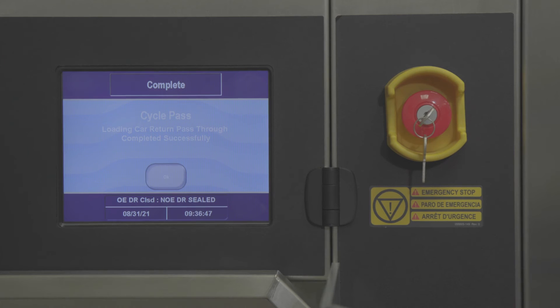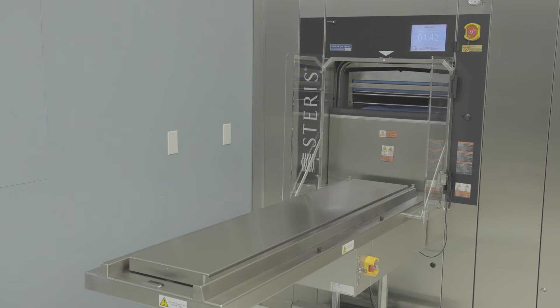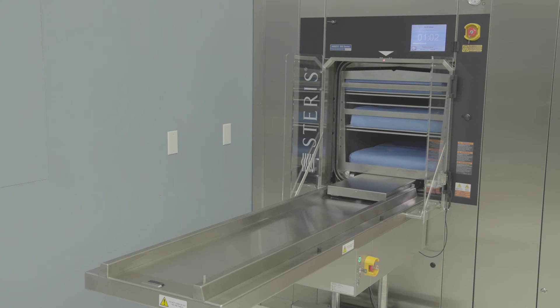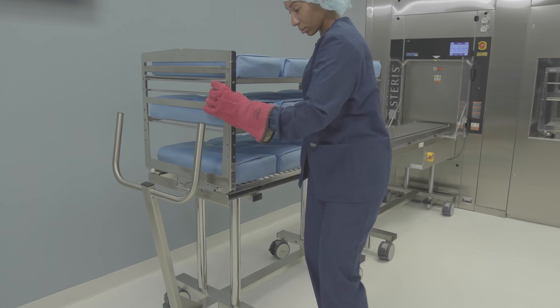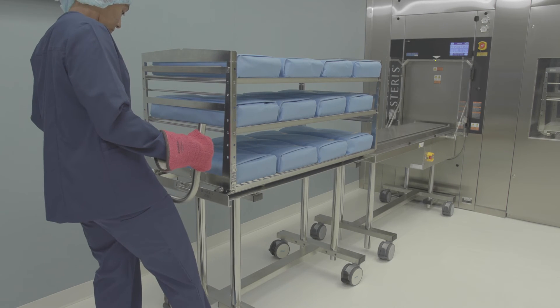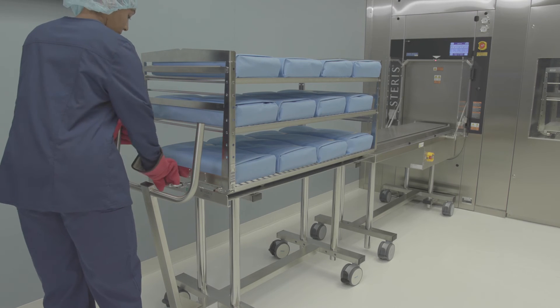When the cycle is complete, the sterilizer automatically detects if a loading car is on the table. If the table is empty, the chamber door opens and the system automatically unloads the processed load from the sterilizer. Exercise caution as the loading car will be hot. Sterilized loads should be removed from the table to a cooling area away from air conditioning ducts, so the next loading car can be unloaded promptly upon cycle completion.